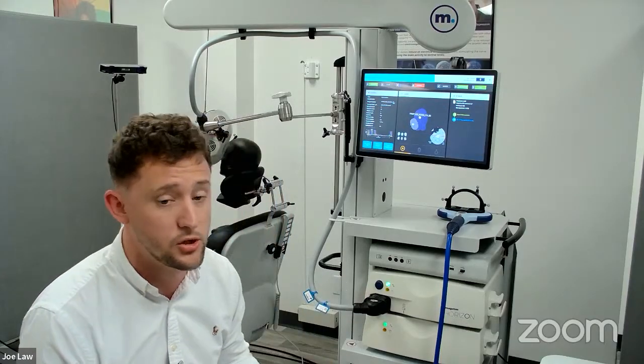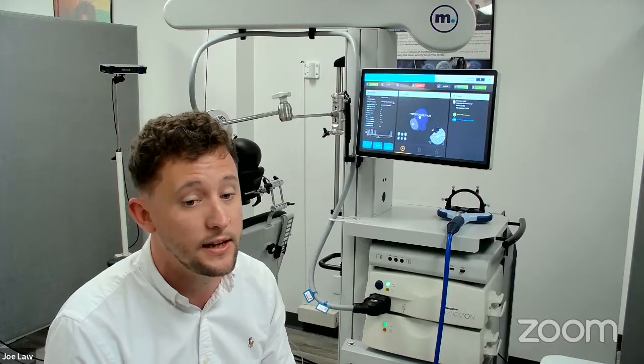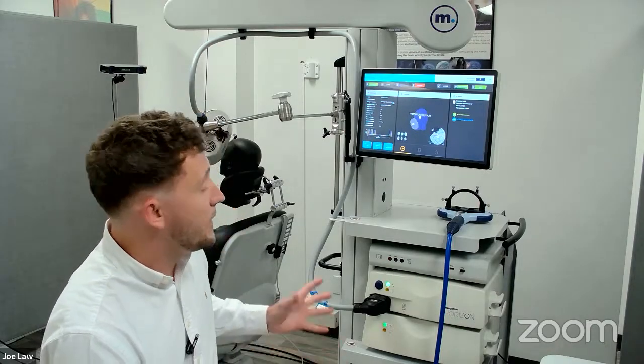So, okay. First question is, can you share more about MRI? You mentioned this before, and does it require an MRI? Yeah, great question. So note, the system does not require MRI. If I'm honest, the majority of our clinics out there currently are not using the MRI function, but I think it's something that might pick up. But we give you that option.